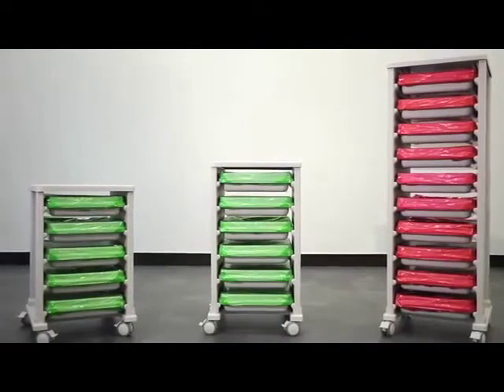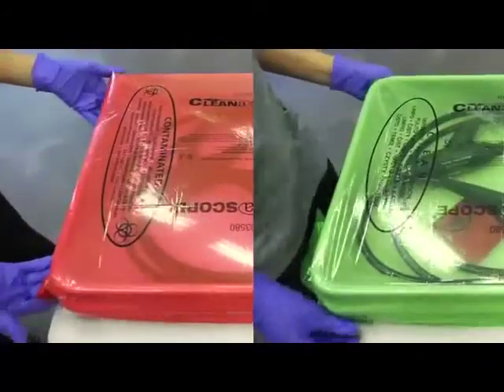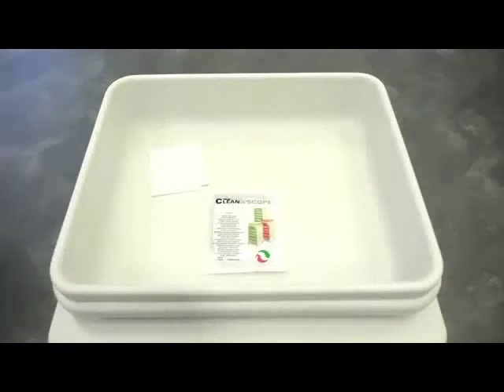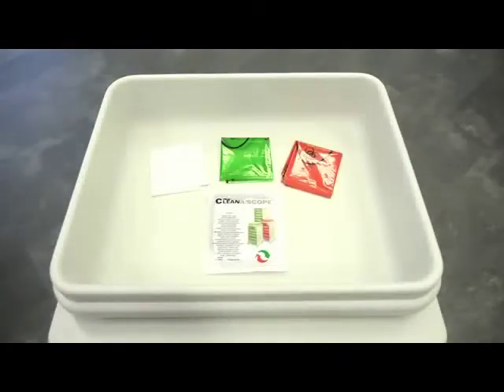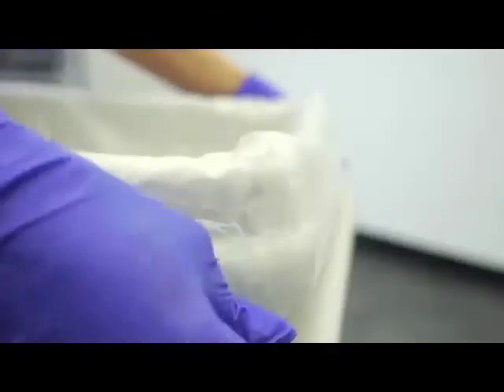Cleanascope is an easy to use system with its reusable transport trays and patented red and green system. Each sterile liner pack comes with a clear liner, a green cover and a red cover. To use the Cleanascope system, place the clear liner over the base of a Cleanascope transport tray. Ensure the liner fully covers the inside surfaces and rim of the tray to prevent the freshly disinfected equipment from contacting these surfaces.